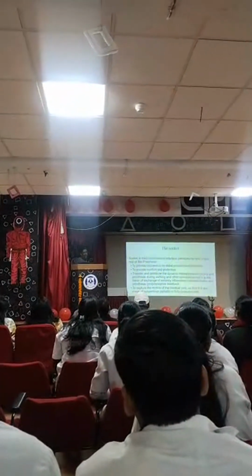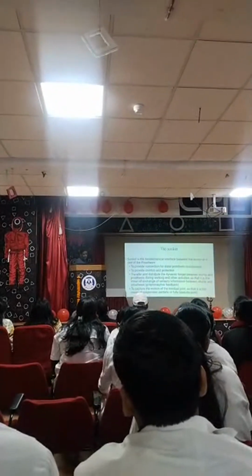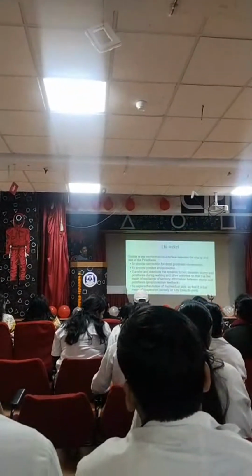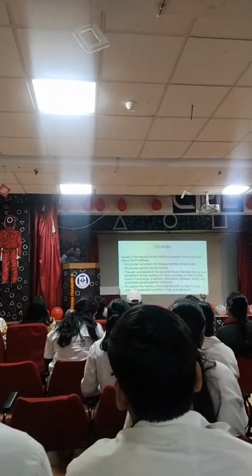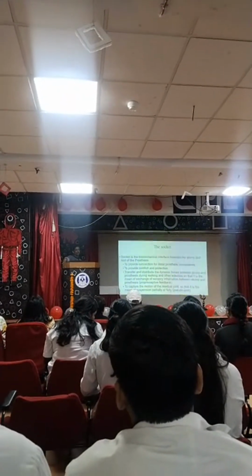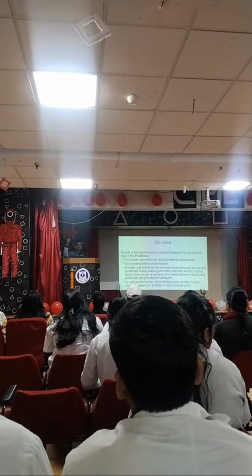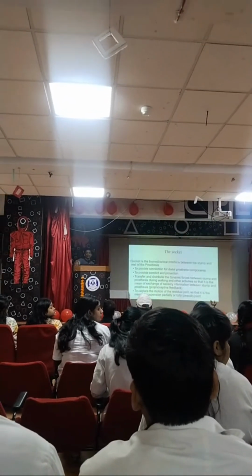Next is to capture the motion of the residual joint. So the residual joint is our knee joint in the case of transtibial. So the role of the socket is to catch the motion of the knee joint. How much it is able to catch depends upon the socket design. As I said, the best capturing of motion of the knee joint is possible when the bone is directly fixed to the rest of the prosthesis, and that is possible by osseointegration.